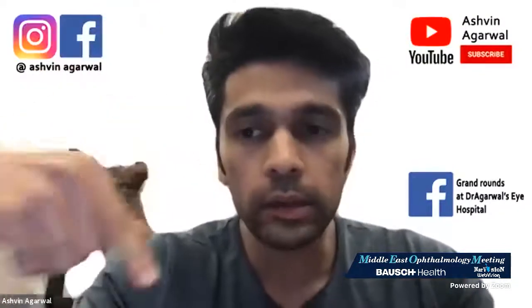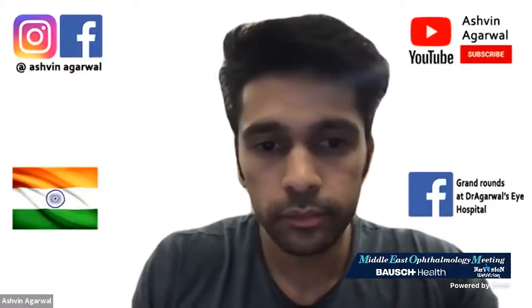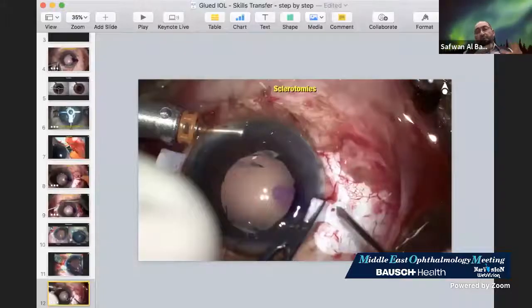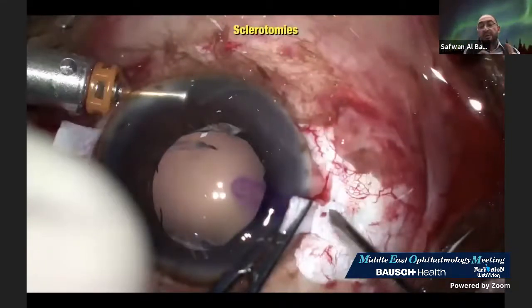I hope I'm getting this through. Yes, it is exactly like that, and this is one of the keys to success for this surgery. Because if anyone goes beyond 0.75, if they extend it to, for example, 1 millimeter or 1.5 millimeters, then they will have shortening of the length of the haptics to go in the tunnel. And that's one of the keys.